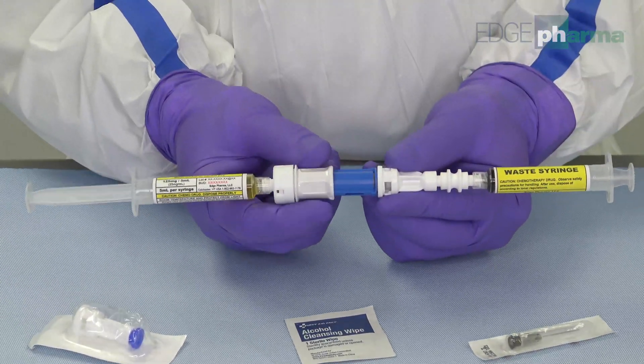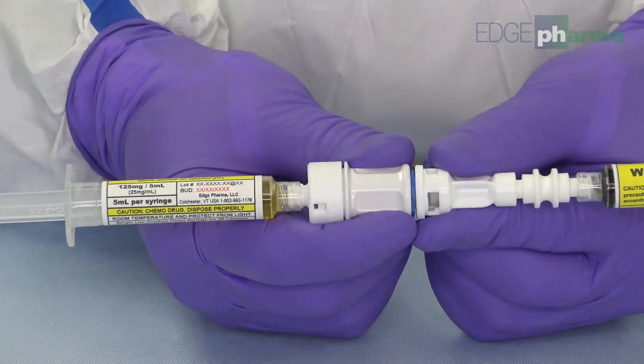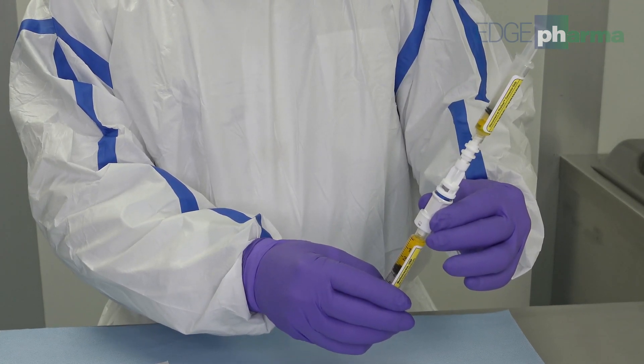Engage the closed system transfer device. Depress the plunger on the administration syringe until the desired dose has been achieved.